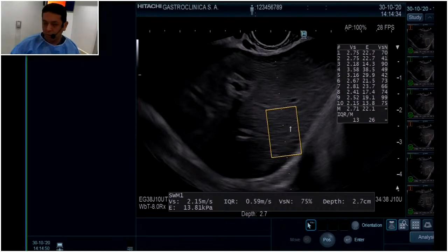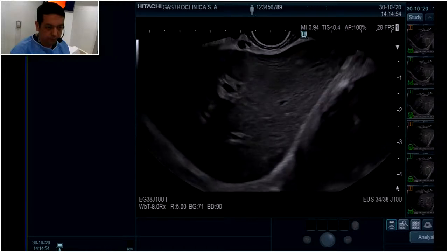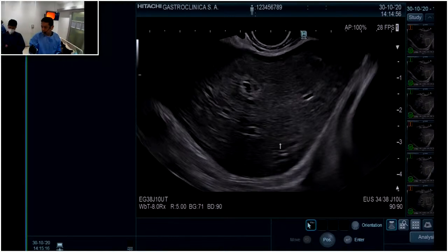Ok, entonces necesito la aguja. ¿Dónde está Clever? So I need to go to this area. This is not proved now as you know. It's just logic. I am trying to apply my logic. So this is the needle. You see here. The shark core. ¿Puedes abrirla? So, retira el estilete, que es este que está aquí.